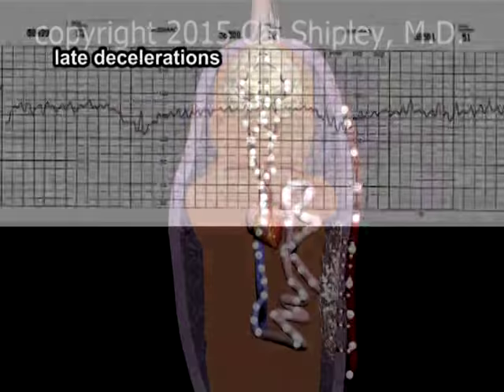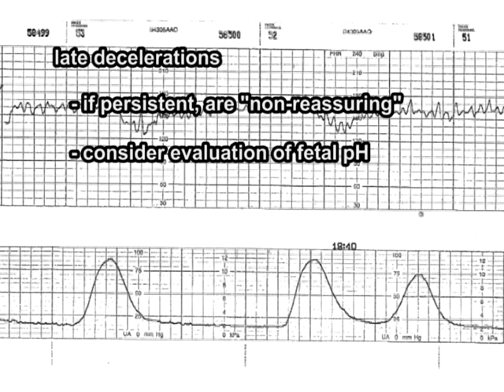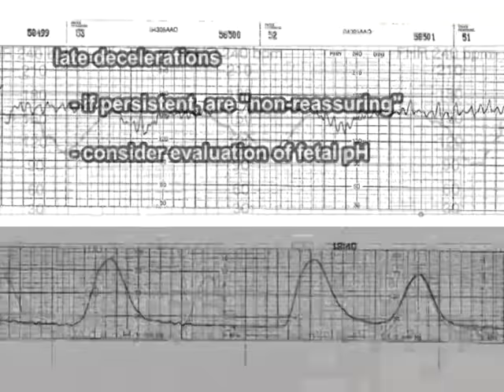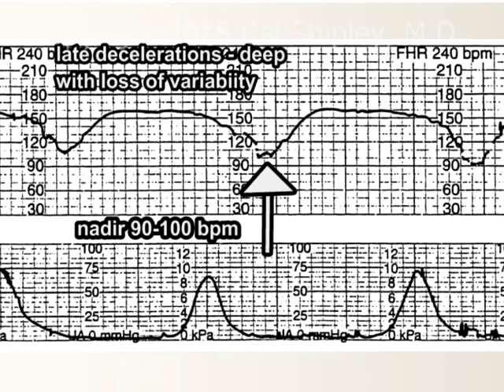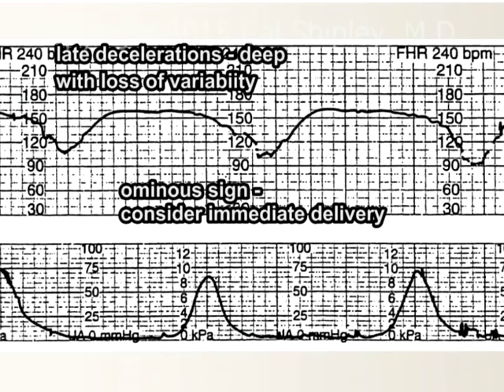Persistent late decelerations are always considered to be non-reassuring, and should trigger evaluation of fetal pH to look for acidosis. Here is an example of deep late decelerations with loss of variability. Note how smooth the tracing line is compared to normal. The nadir of each deceleration reaches 90 to 100 beats per minute, well below the normal level. Loss of variability in the presence of persistent late decelerations is an ominous sign, and should prompt serious consideration for immediate delivery.